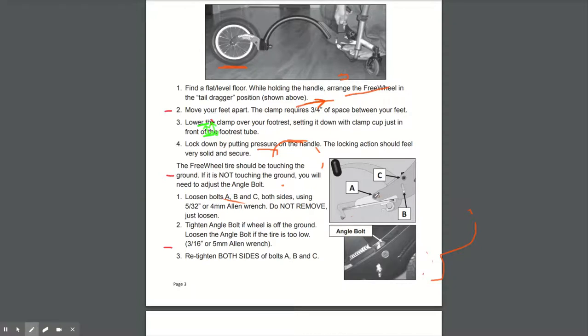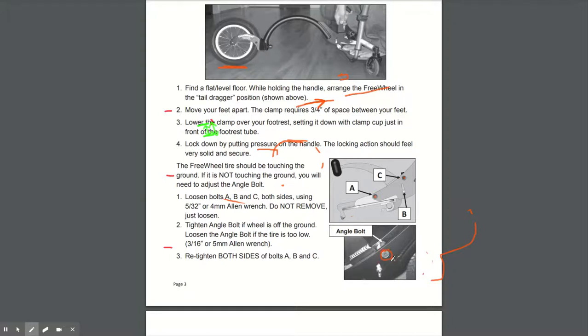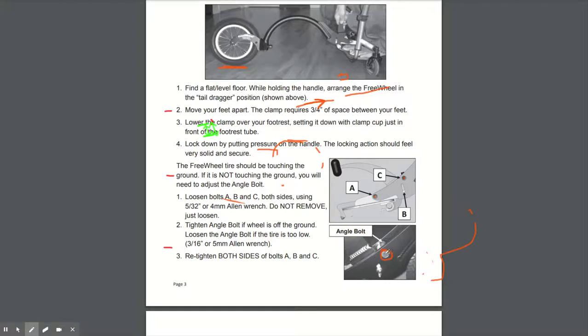So be careful when you're undoing these bolts here and ensure that the Allen key is pushed in because they may slip when you're undoing them and damage the Allen key or damage the bolt itself. So be careful when you're undoing A, B, and C and push the Allen key in to make sure that it's properly inserted into the bolt so that it doesn't slip and damage the bolt head.